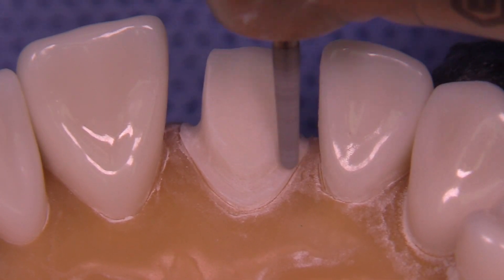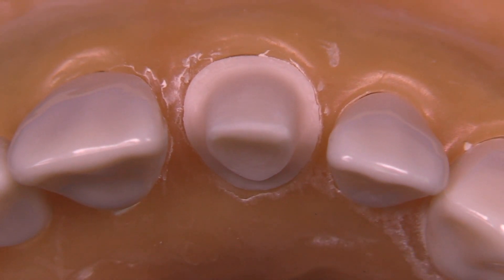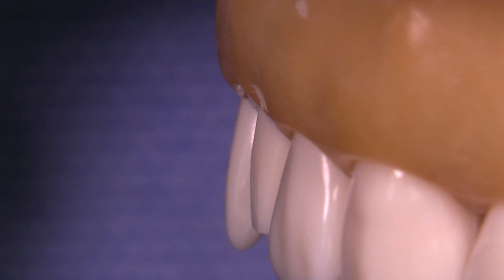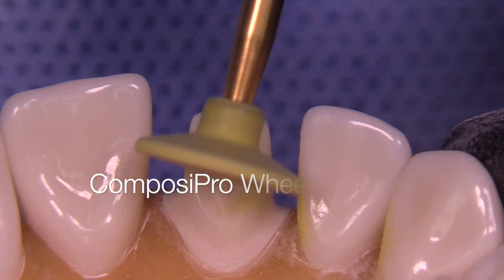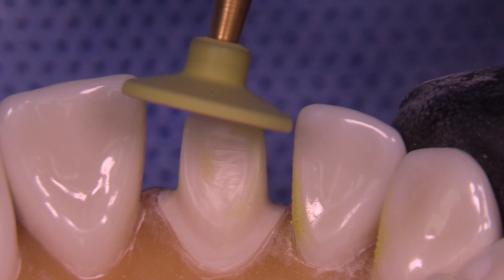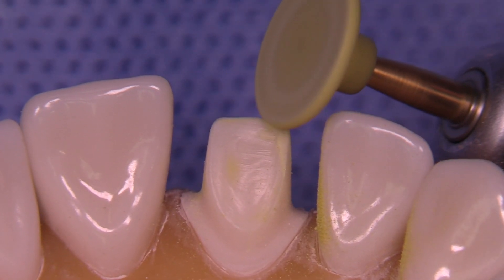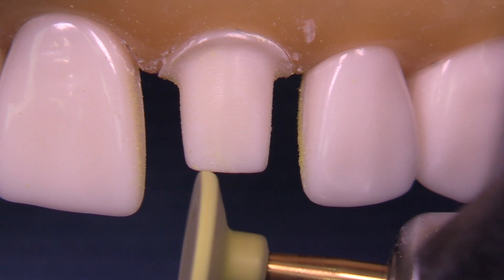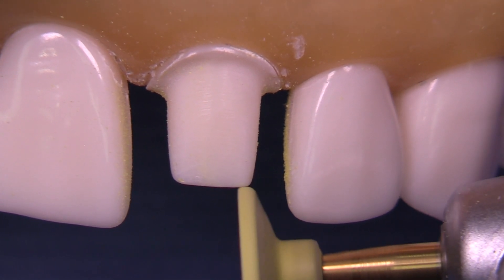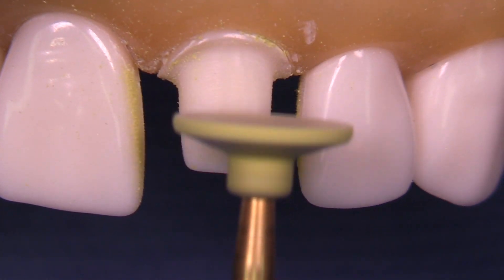You can use a low speed or electric handpiece with reduced speed to make the preparation really fine. We're ready to move into the refinement phase using the Composi Pro wheel — we have a cup and a wheel made by Brassler for this 5x5x5 kit. We're calling it the 5x5 because it's basically five burr steps with five different burrs for each preparation, and the other five would be five minutes. Some of you might not be able to do it in five minutes yet, so maybe we'll just call it the 5x5 technique.